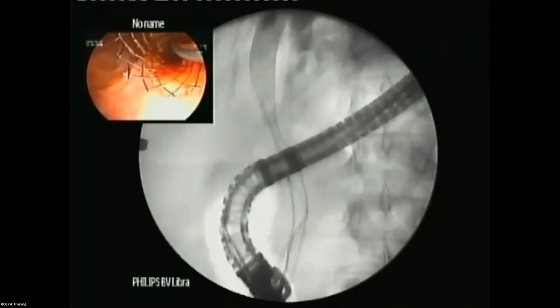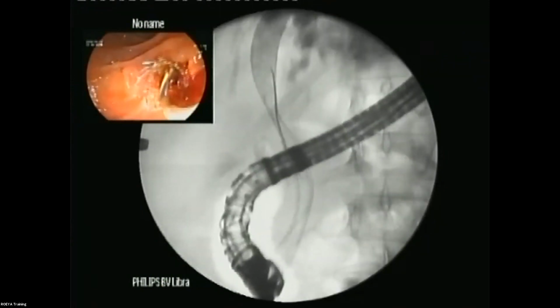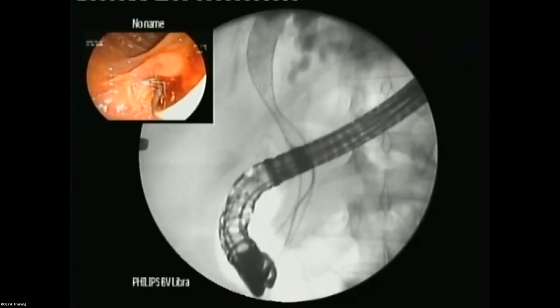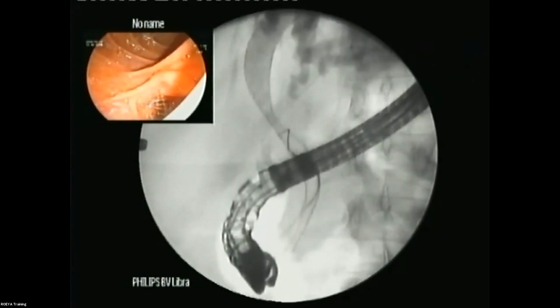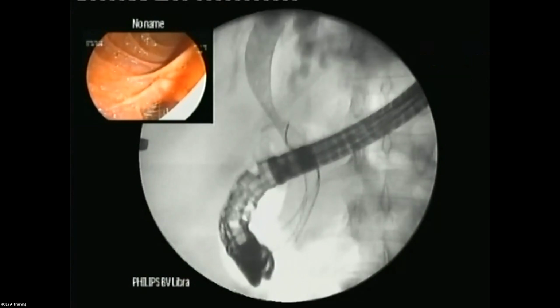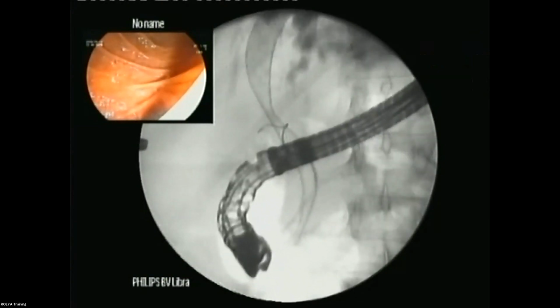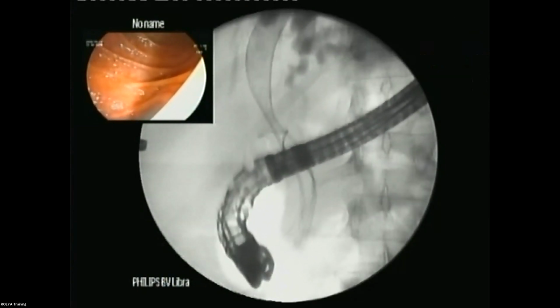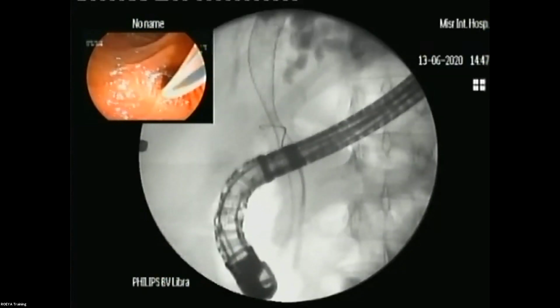But for the hilar tumor, I always work prone. I prefer the prone position normally. The prone position is better because it avoids the secretions covering the papilla. But on the other side, the supine position keeps the anatomical orientation of the biliary system clean enough.